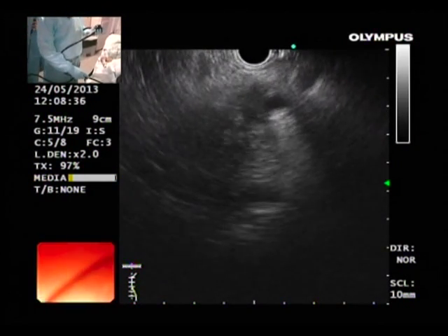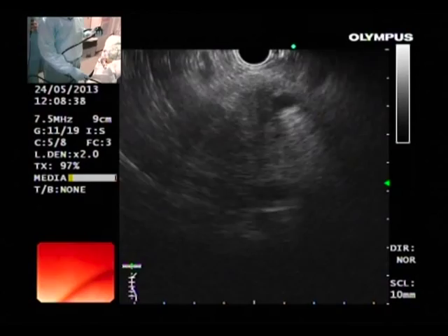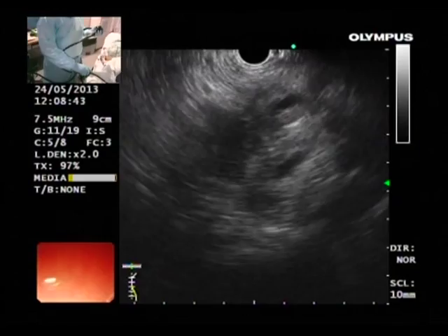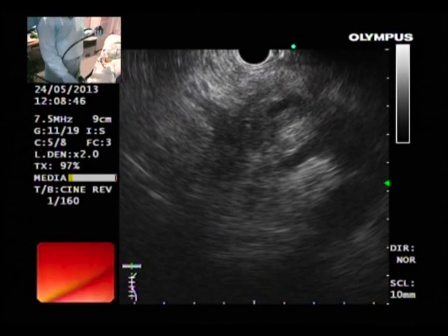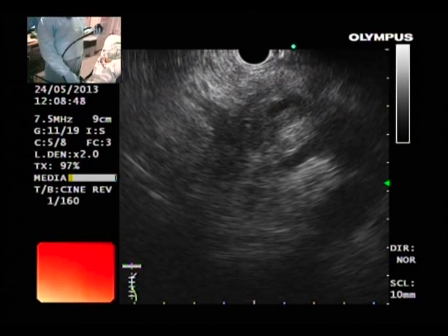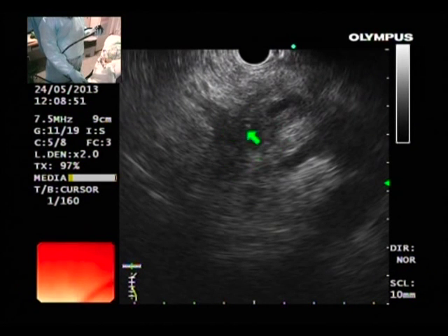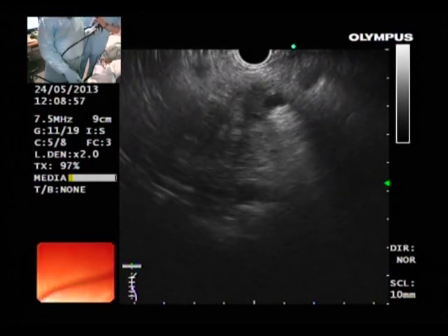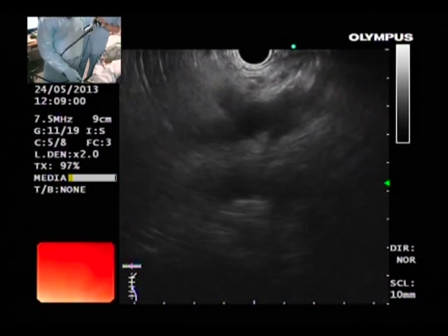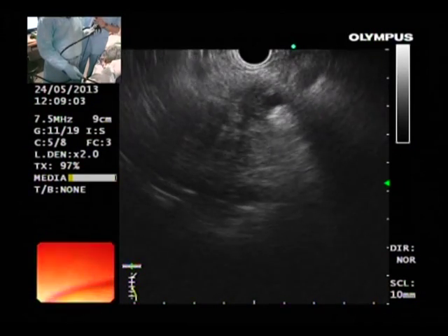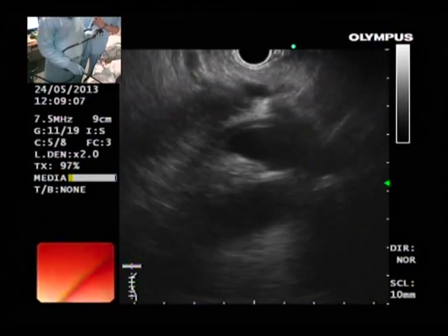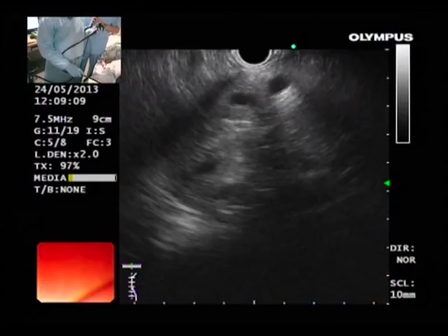If we trace this pancreatic duct forwards towards the head of the pancreas, you see it stops here. It seems like there is a hypoechoic mass — yes, you are right. So this is the pancreatic duct and there is a lesion in the head of the pancreas. The message I am trying to convey is that if you follow the anatomy, most structures are visible from the stomach: head of the pancreas, SMV, SMA, and our area of interest — the aorta.